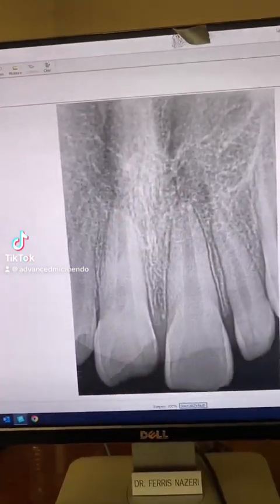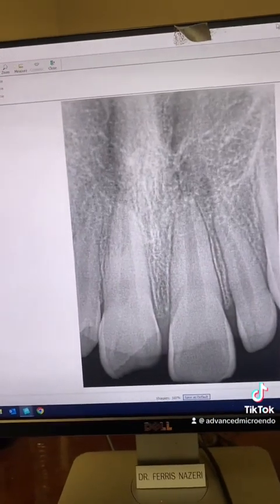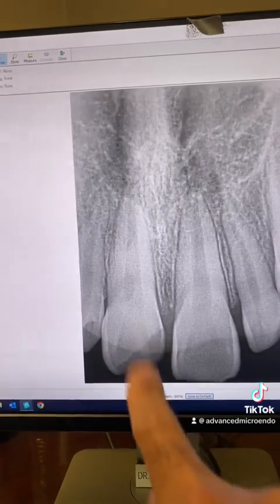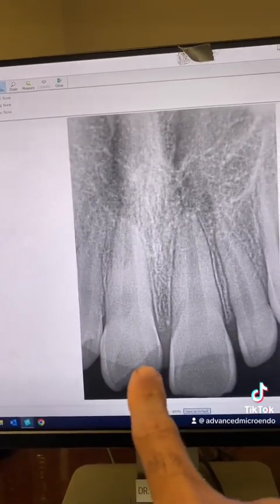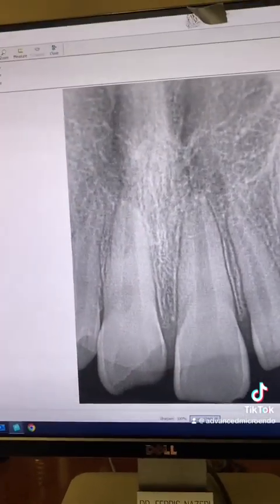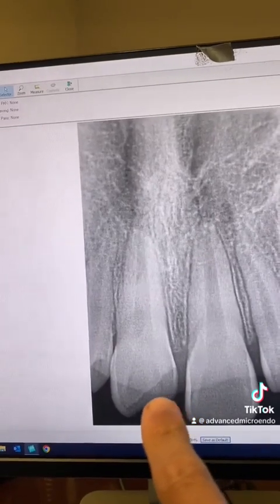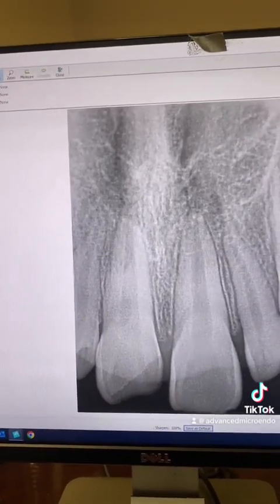Endodontic treatment of tooth number 8. This 10-year-old patient traumatized her tooth number 8. And as you can see, there's a pulp exposure right there. Look how far coronally the pulp horn extends. So when she traumatized the tooth and cracked the tooth, there was pulp exposure right there.